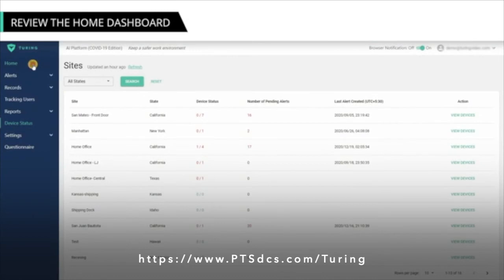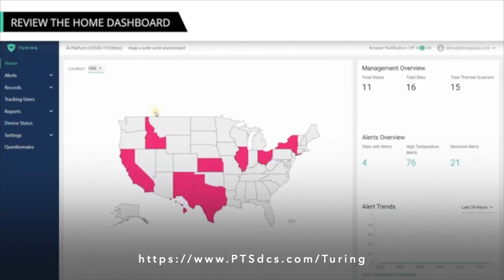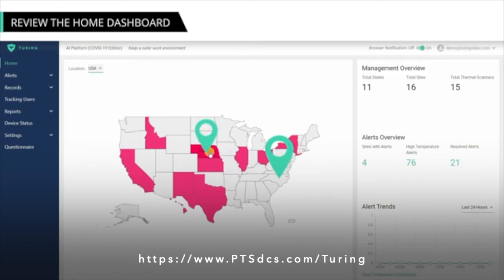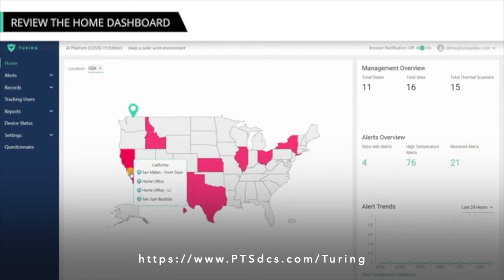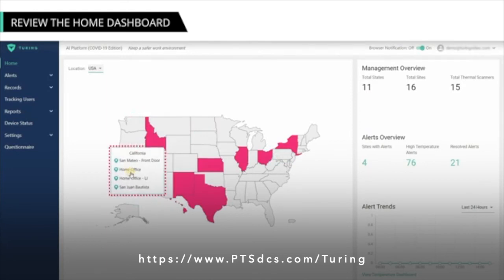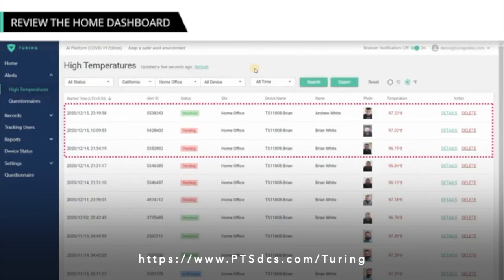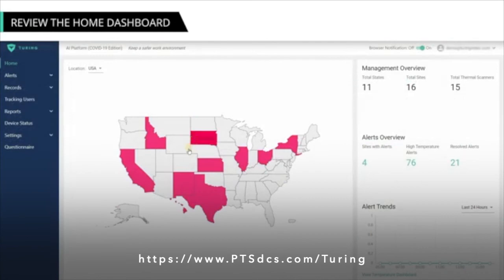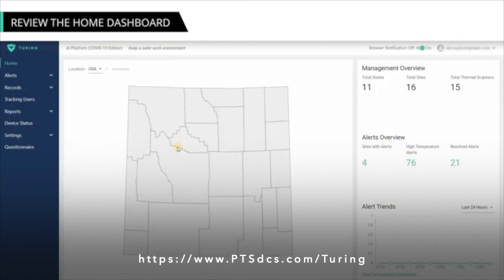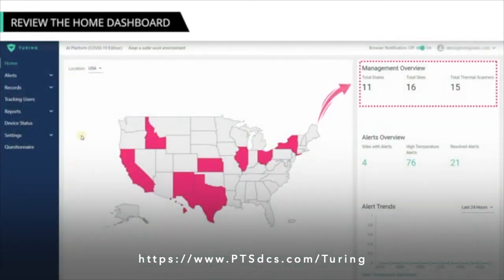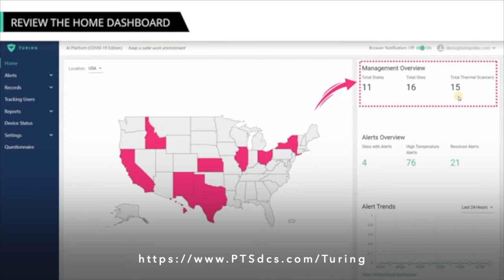The Home Dashboard consists of a US Map showing all the devices set up for your sites, with all states highlighted. You can hover over or click appropriate portions to view the alerts, and view different sites with alerts and alert trends. For example, you can choose to view CityWise alerts or select a state. On mouse over, the specific state, province, or territory gets highlighted. You can click a specific location on the pop-up to view the high temperature status of the corresponding sites and devices for that location. If you click on a state which is not highlighted, a new page with the image of the state will appear expanded. The Management Overview to the right of the map informs you of how many states have the scanners installed, how many sites have the scanners, and the total number of scanners across all states, provinces, territories, and sites.